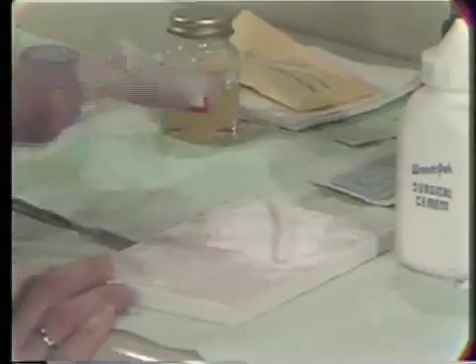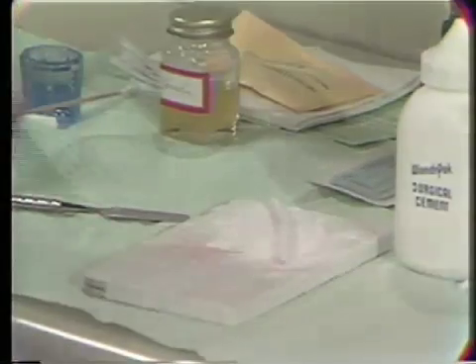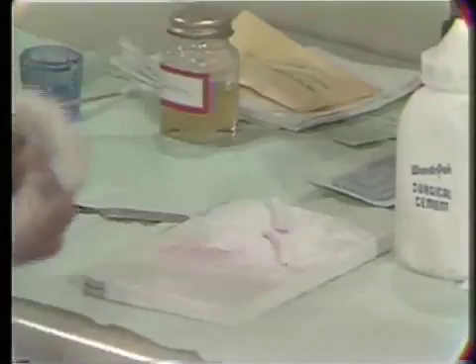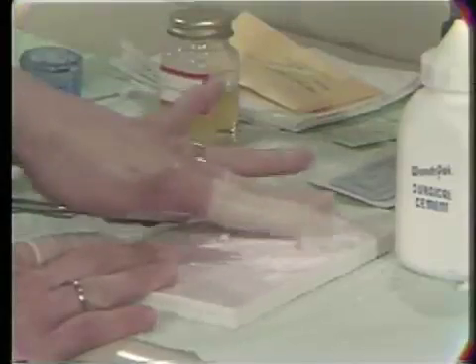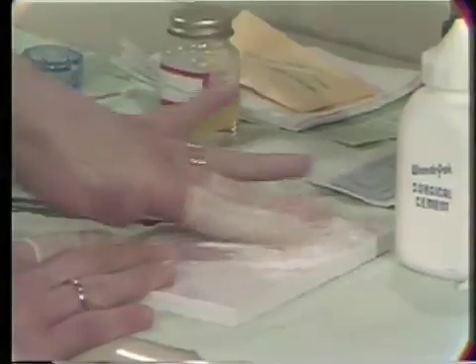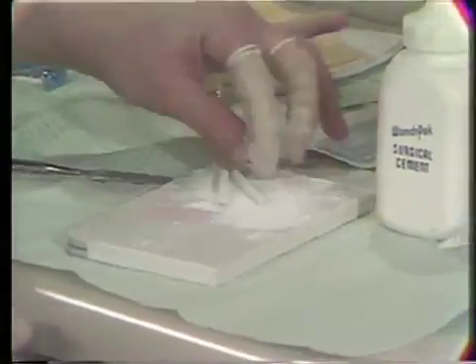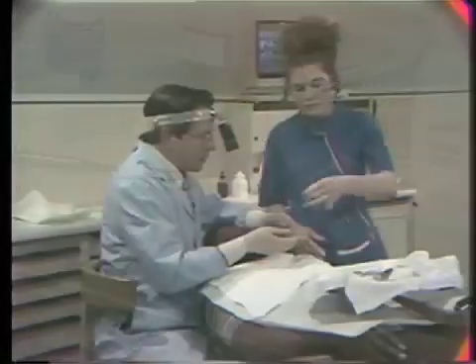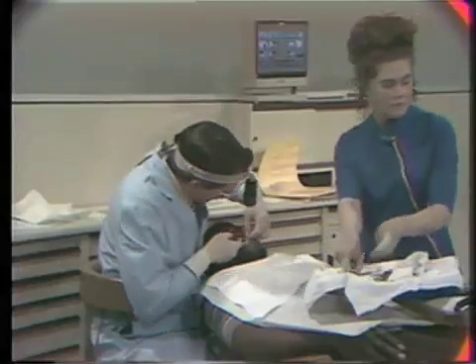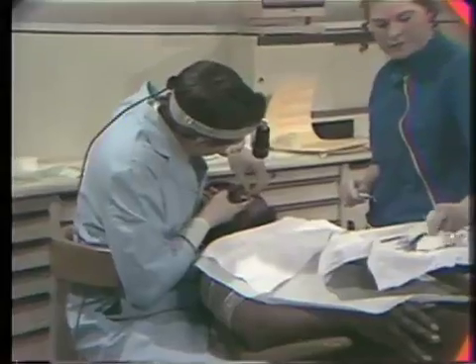And the reason for that is you don't want the dressing material sticking to yourself. Once it's placed in between the teeth and wedged in there mechanically for retentive purposes, you want it to stay there and not come back out. It does get embarrassing if you place that dressing material in between the teeth and push it in several areas, then you bring your finger out and it comes with you. So the powder on there makes it not sticky to your hands or your rubber gloves. See how she's dropping it, getting a little bit of the excess, and then she hands it to me, and then I'll go intraorally. Do the dressing.